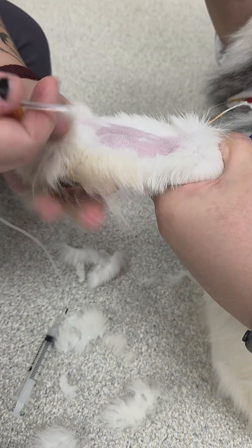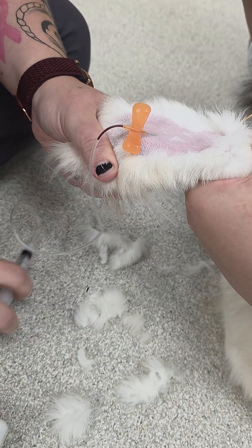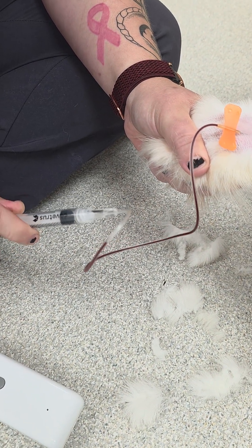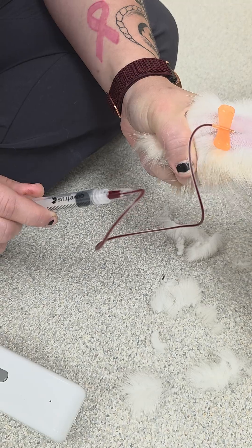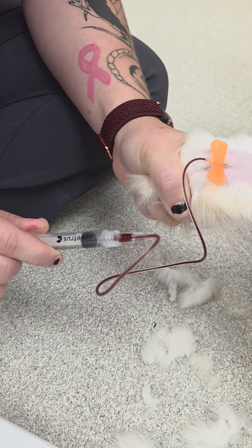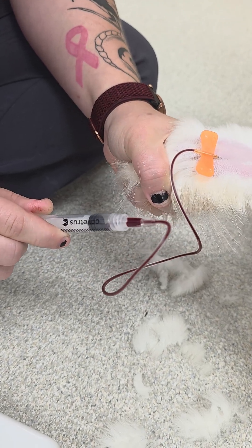So for here, you'll use a butterfly and just go into the vein and pull your blood. If blood flow is slow — which this is, like I said, last resort — then you'll have to pump the paw to get it to flow. But that's it. That's all your last vein that you can draw from.